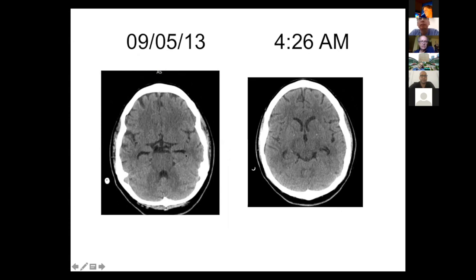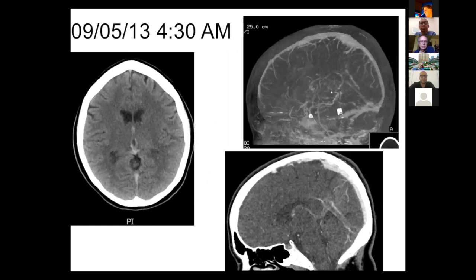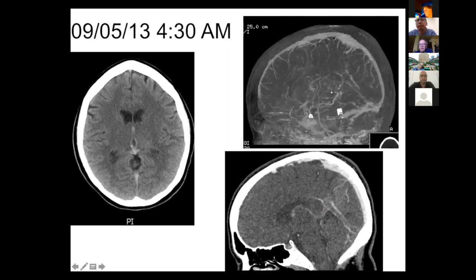At one o'clock in the morning, the only change was the spontaneous high density of both internal cerebral veins. At four o'clock, the repeat CT scanner showed some hypodensity in the mesencephalon and dilatation of the temporal horns, as well as some dilatation of the ventricles and hypodensity. The CT angiogram in sagittal view showed a fault of filling of contrast in the straight sinus.